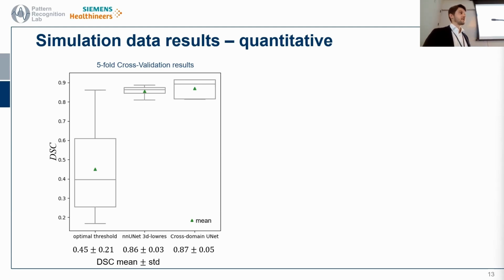I would hypothesize that those are the samples with very few metal artifacts. Comparing the 2 other methods, we see that they perform fairly similar with 0.86 and 0.87 mean average dice coefficient. I wouldn't read too much into the tiny differences in the standard deviation.